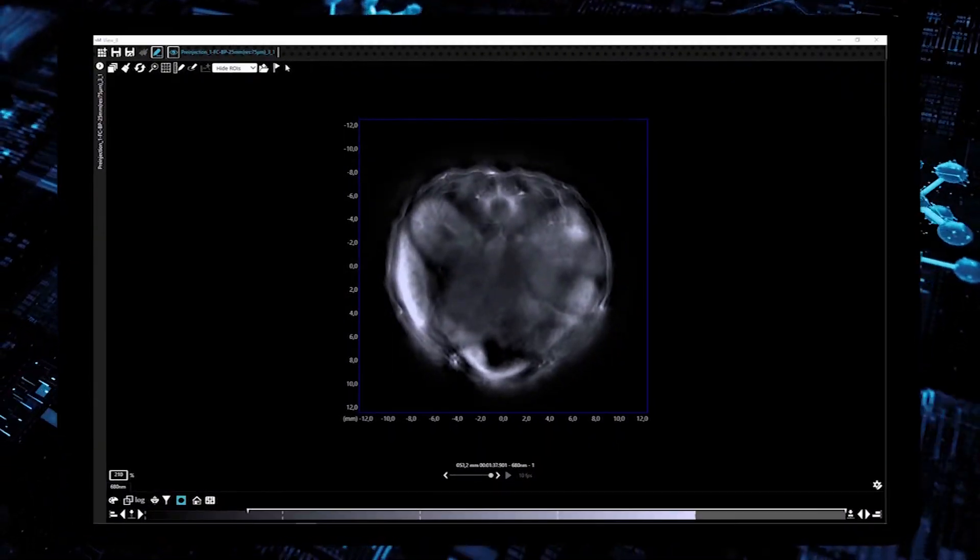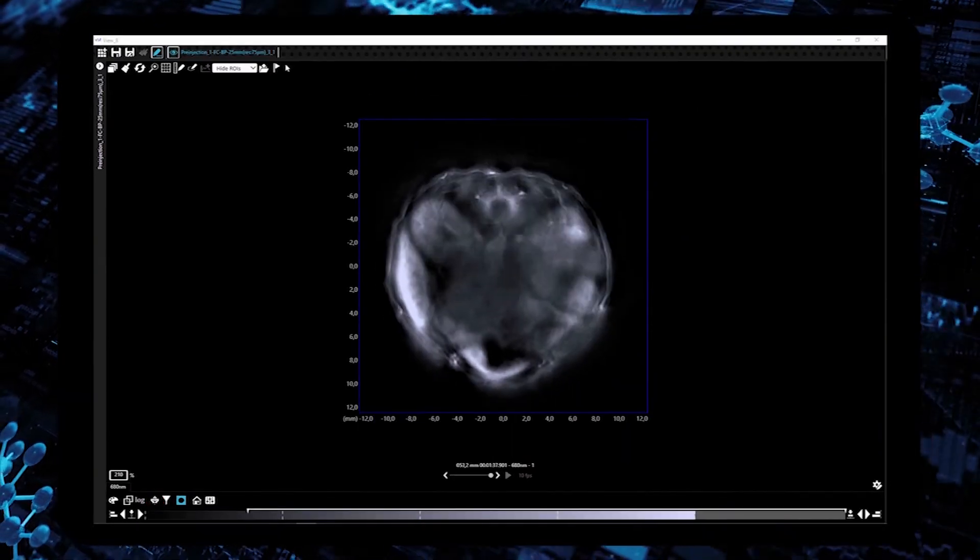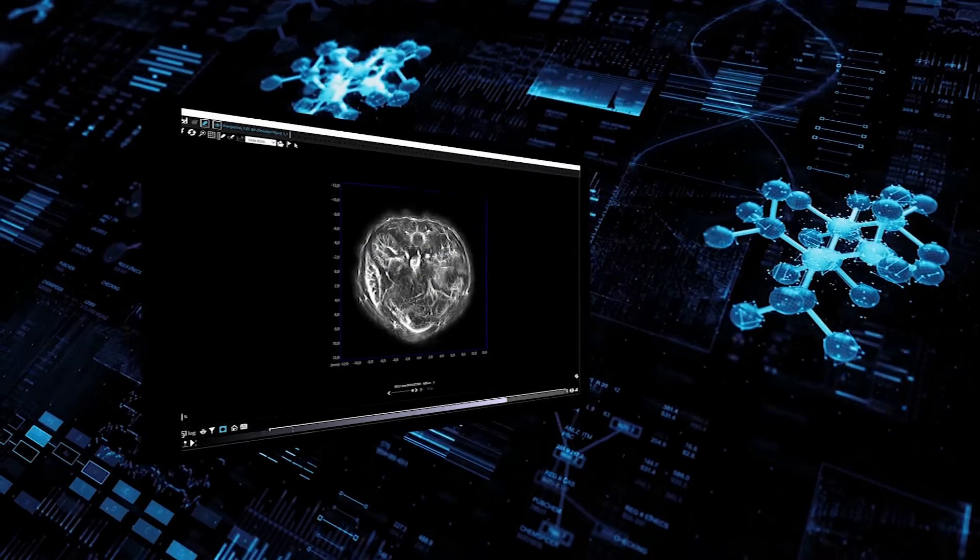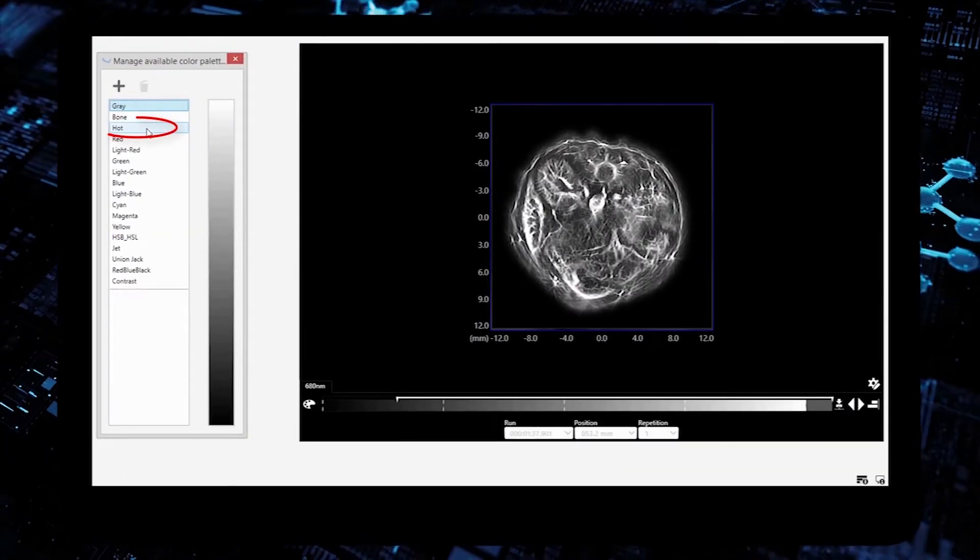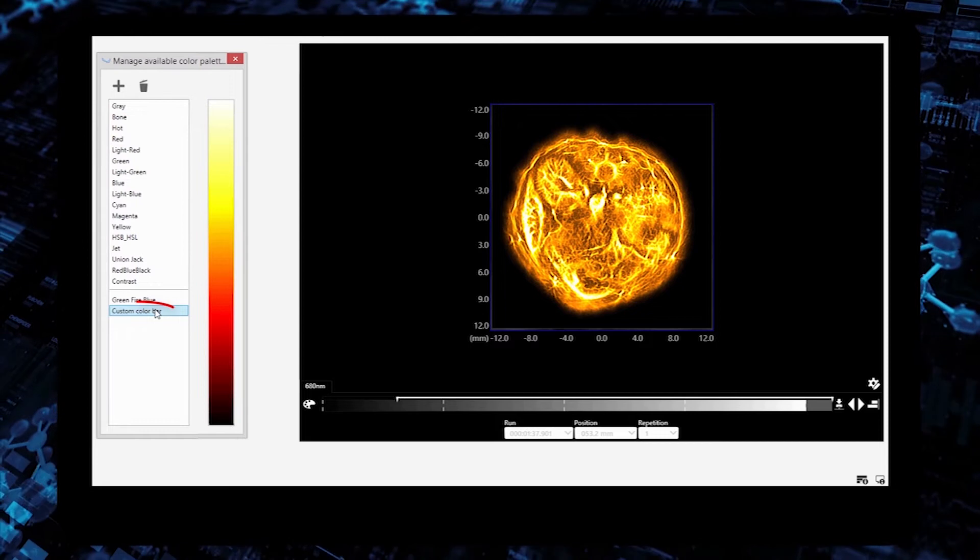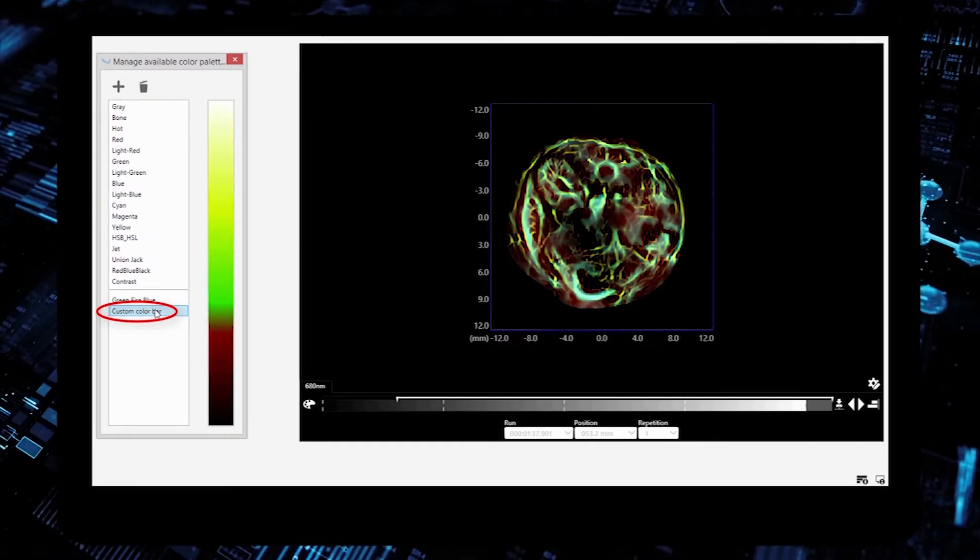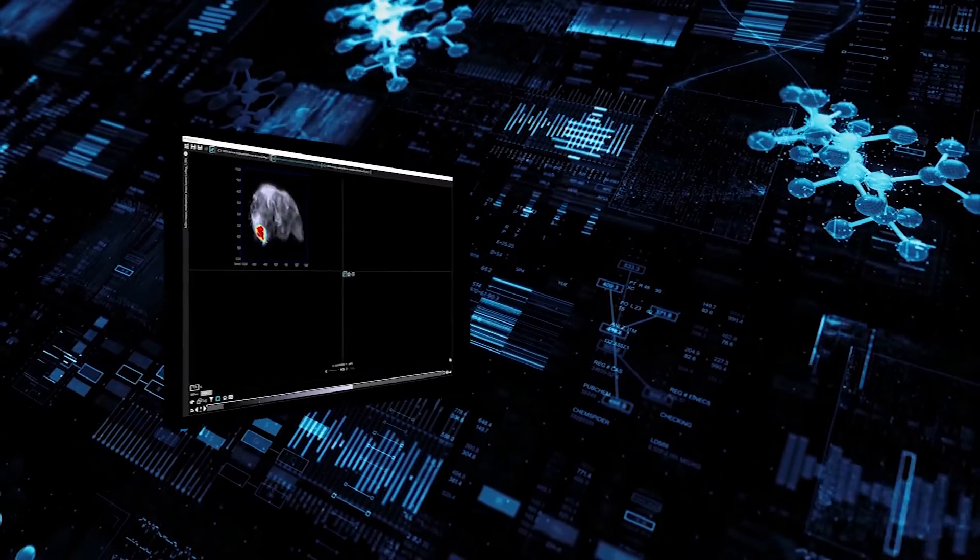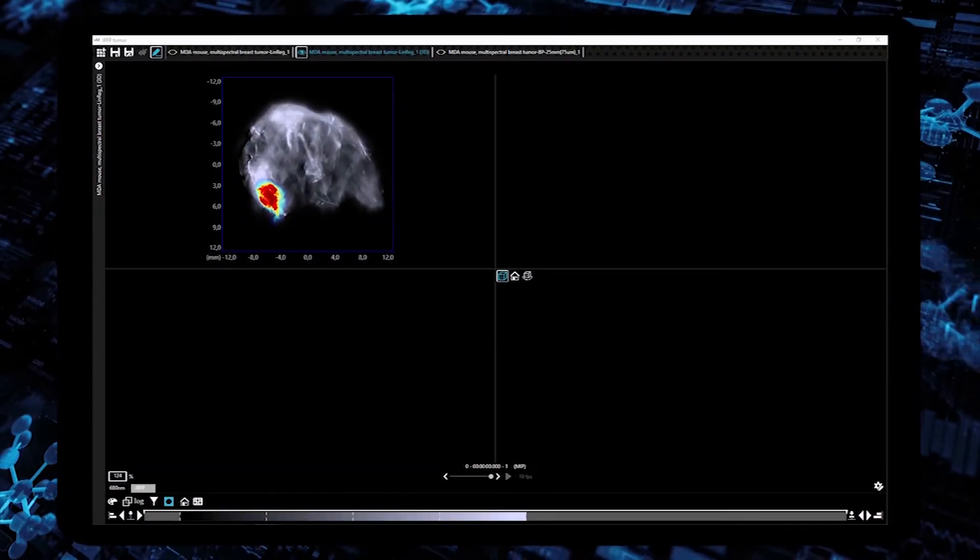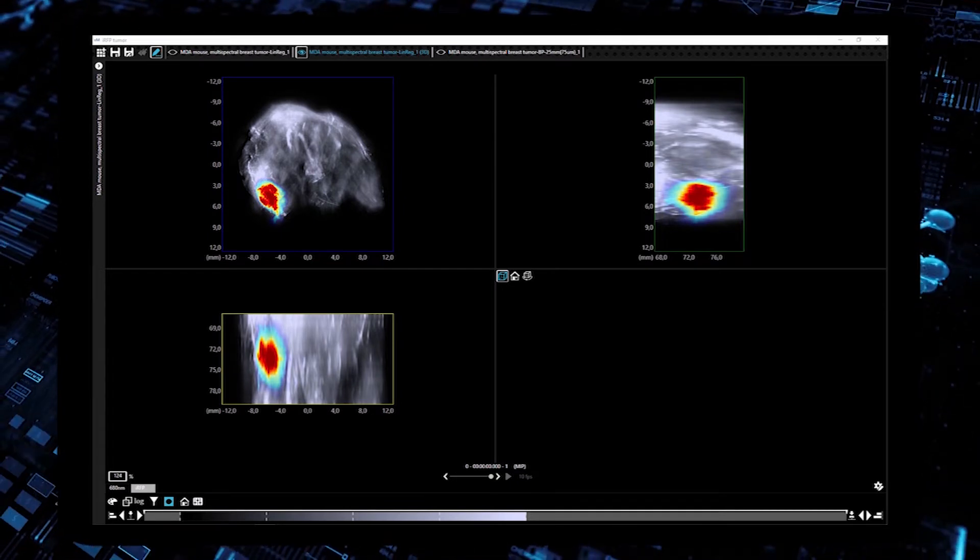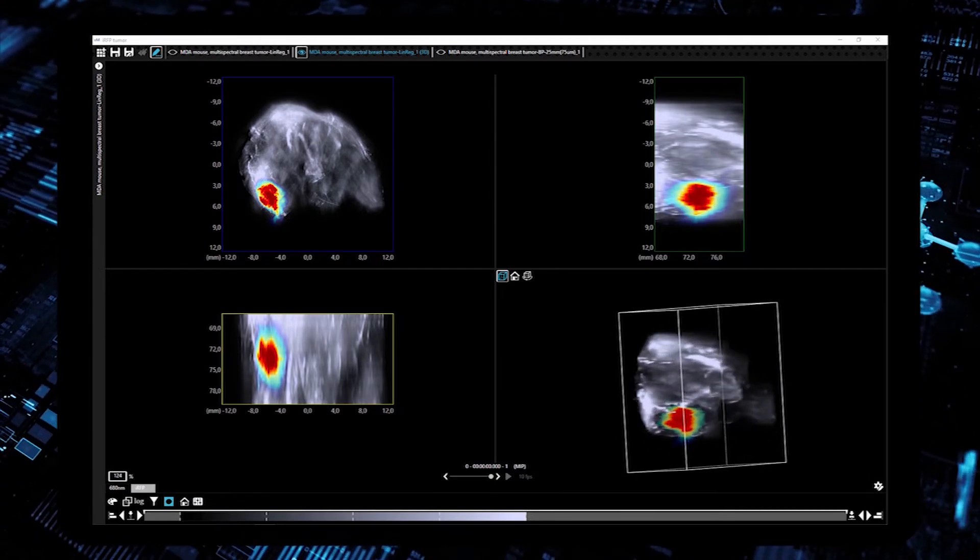Users can apply image filters to enhance structural features, pick color bars for visualization, plot multiple slices as orthogonal maximum intensity projections, or render 3D volumes.